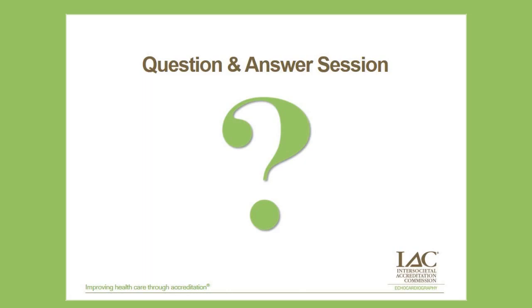What was the second part of that, Sue? They want to know if you do limited or full echoes when you do the serial echoes after chemo. Yeah, we kind of get a mixed bag here. I would say for the most part, we do a full echo on every patient. There are some physicians in our cancer center that will order limited for the serial exam.